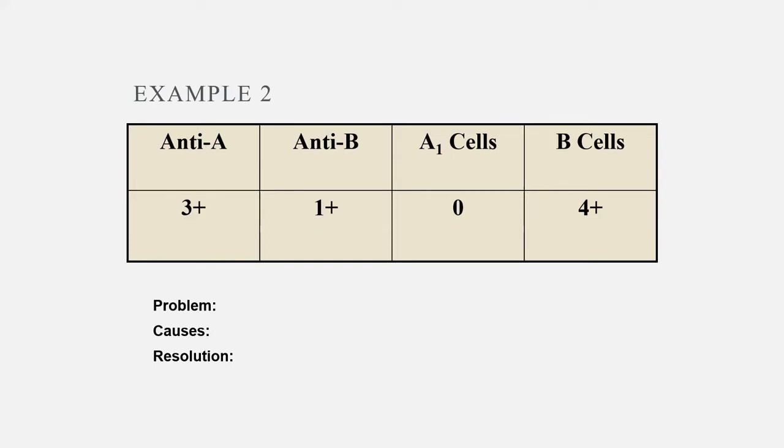It's an acquired B caused by gram-negative bacilli, like within the gut. Yes, thank you. This is a very common board exam question: acquired B. What's the resolution? Well, for the cause, you're going to look at the diagnosis. If it's any kind of colon cancer or any kind of intestinal bacteria, it's going to resolve once the infection is cleared. So there's really nothing you can do about it while it's happening. But you would write this up.